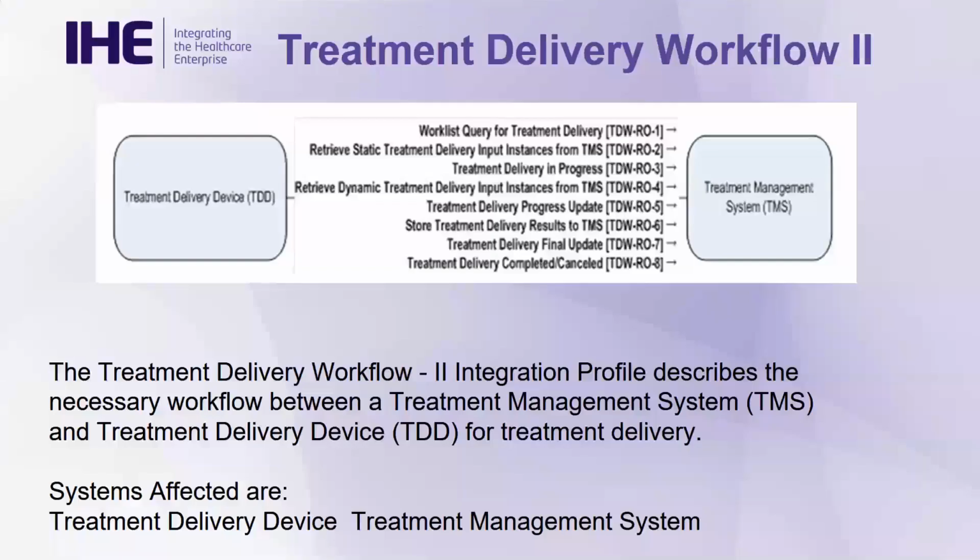And another example of a workflow is the treatment delivery workflow. And again, you can see the two different devices, and those are all the transactions that happen for the workflow between the two. I'll save a comment for a little bit.